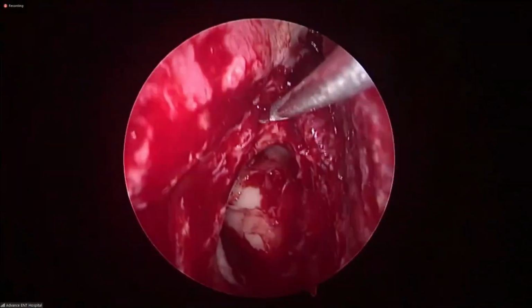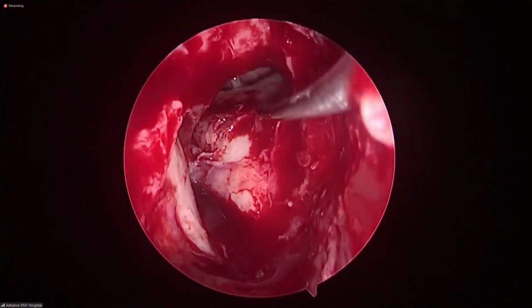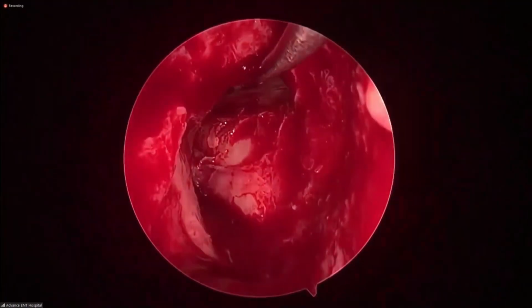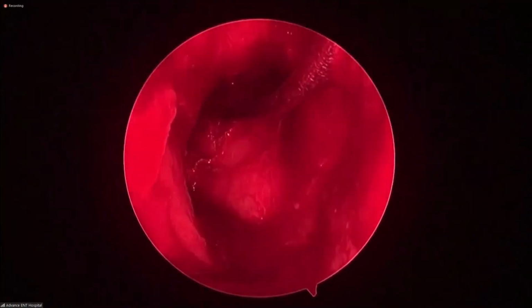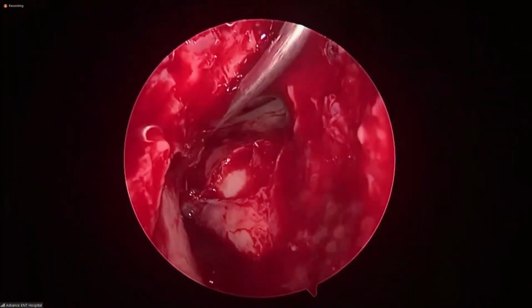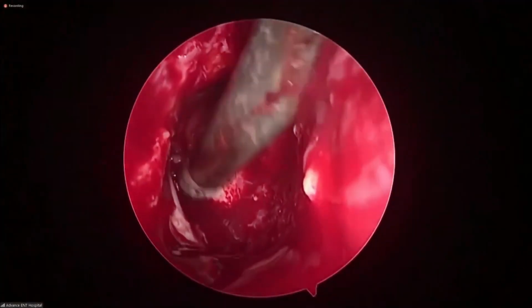See now, the first thing anterior to posterior, I showed you the beak. Then the narrow frontal sinus opening. Then there was a cell which was extending from there to the base of skull. I fractured that cell and flushed it with the skull base to widen this opening. Got my point or not? Simple. Absolutely clear, sir. So that was a situation where the cell was obstructing from behind.